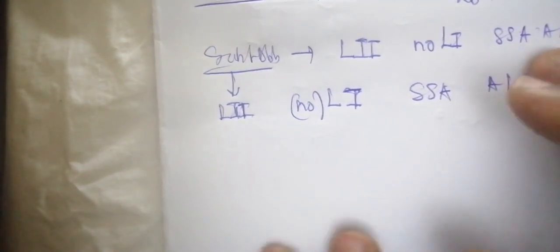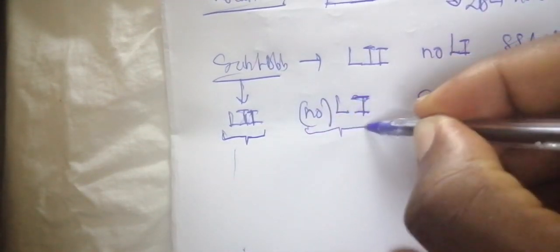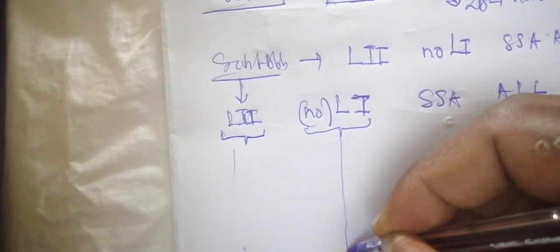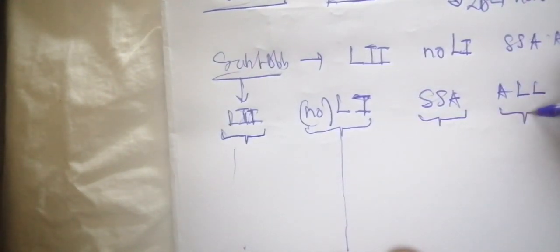Generally that's that. Now, how do you cram this mnemonic? The first part corresponds to the first 3 leads on the vertical aspect of the ECG graphical representation. The second part represents the next 3 leads, the third part the next 3 leads, and these are the next 3 leads.